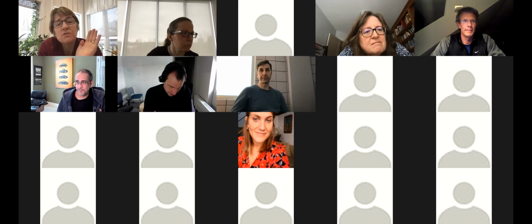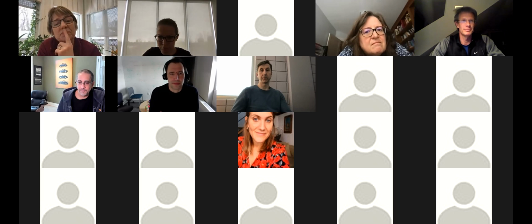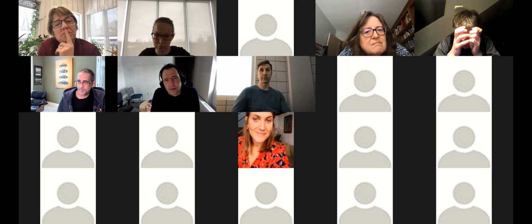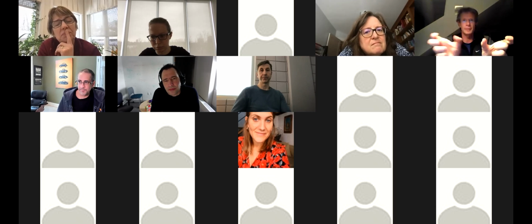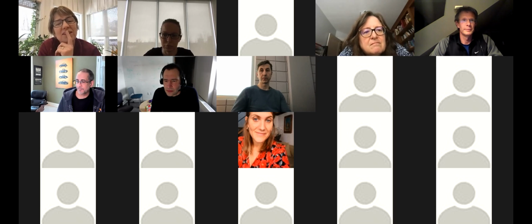Maybe this is a naive question. No, it's not naive. I wish I could say yes, there is a way to compromise, but there isn't really. The compromise in your spatial resolution really comes from having to accommodate multiple echo-planar readouts and still get a reasonable echo time. So no, there isn't anything you can do really. Okay.